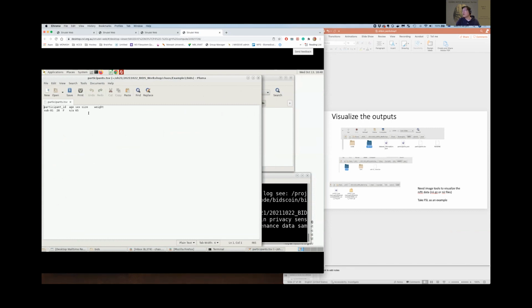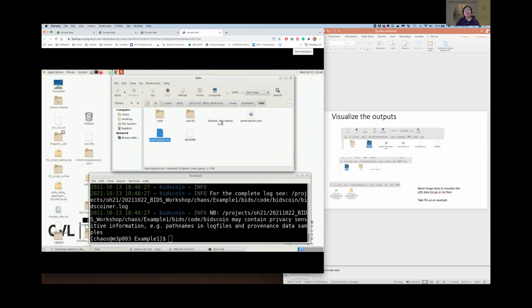All of this is extracted from DICOM. For some reason, when I validate against the BIDS validator, it gets stuck on the participant JSON file. But if you remove it, that's totally fine. It doesn't stop you from other processes such as MRIQC.